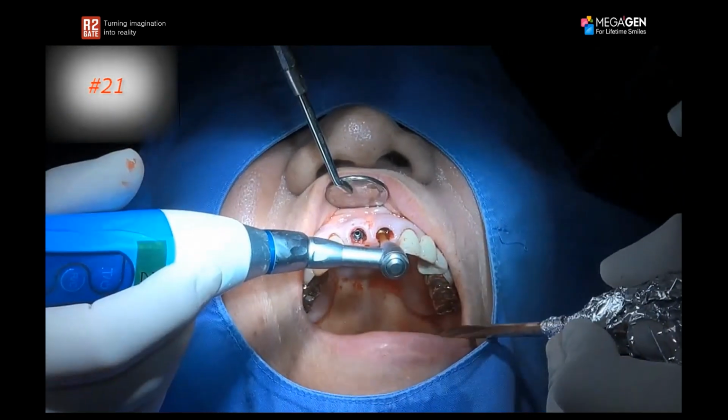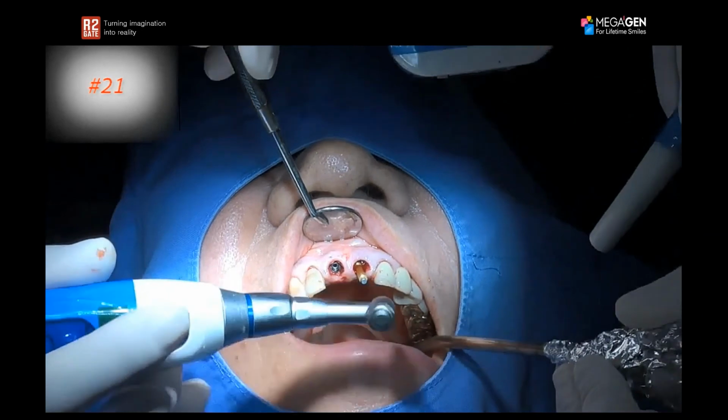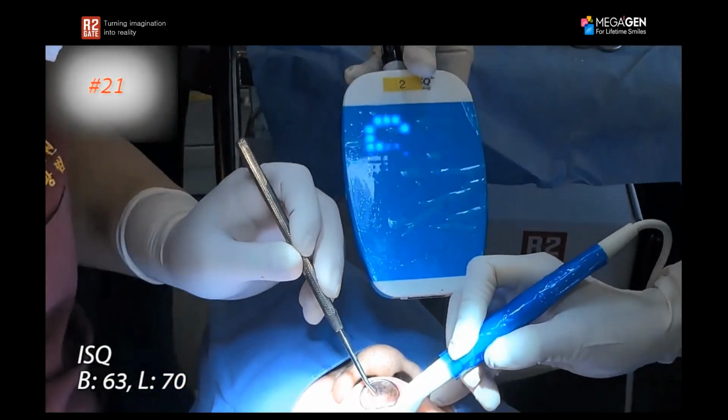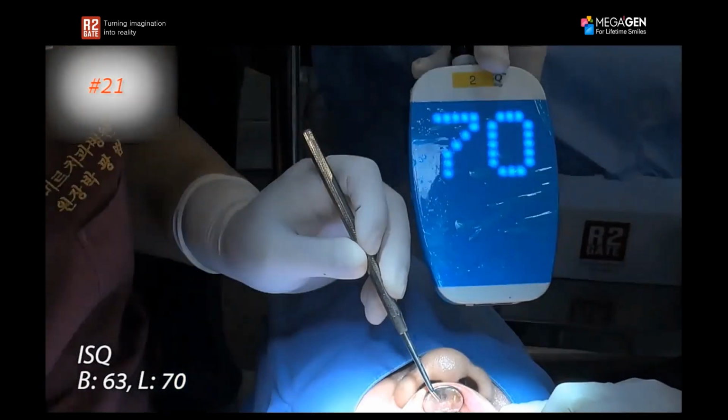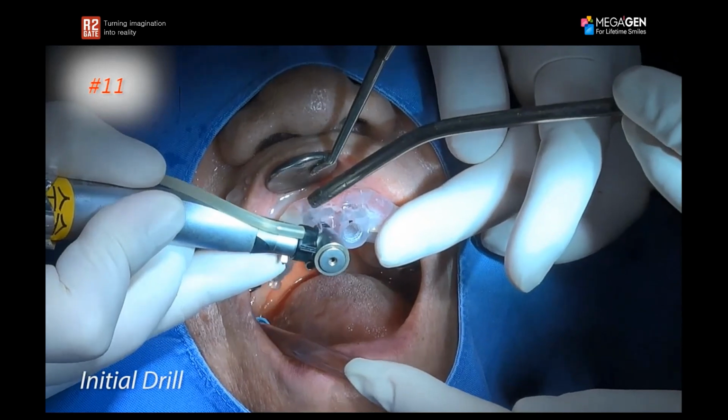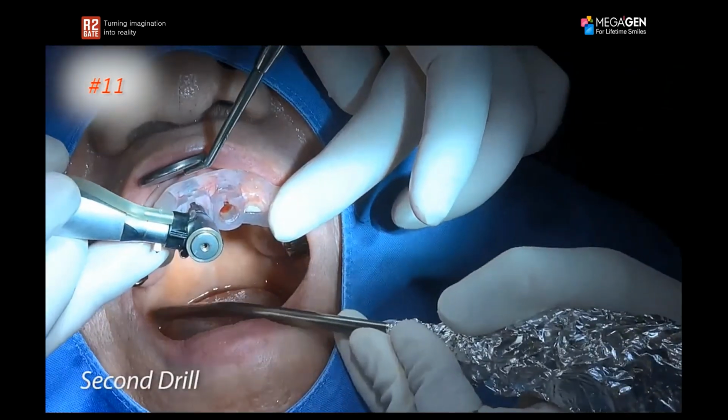I'll then place my smart pegs to measure ISQ. I'll take measurements on the buccal side and on the palatal side as well. Here I got 63 and 70 for my implant. And now I'll move on to start drilling for my other implant.